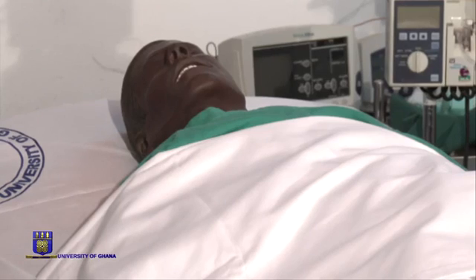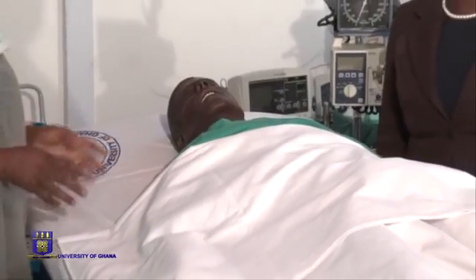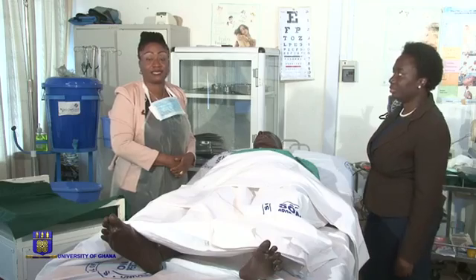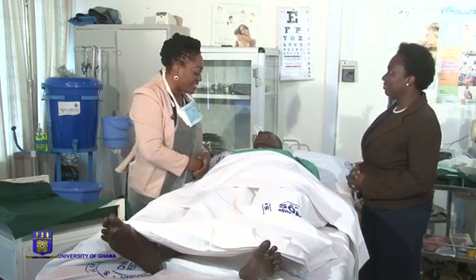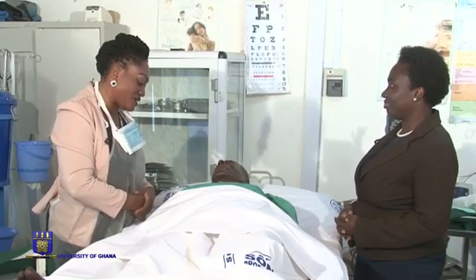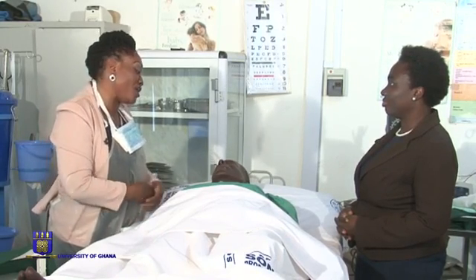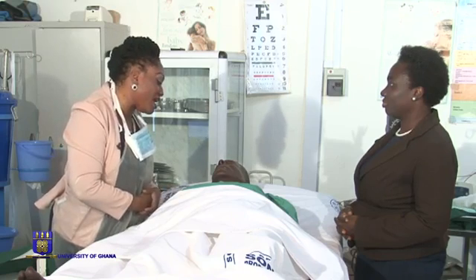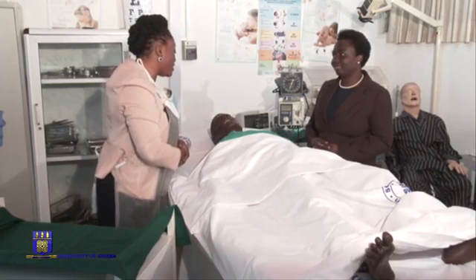Okay. Now, before the wound dressing, the procedure is supposed to be explained to the patient. So, good morning, Mr. Osei. I am Nurse Anson, and this morning I'm here to dress the wound on your hand, as we've been doing every morning. Today I came with one of my colleagues.